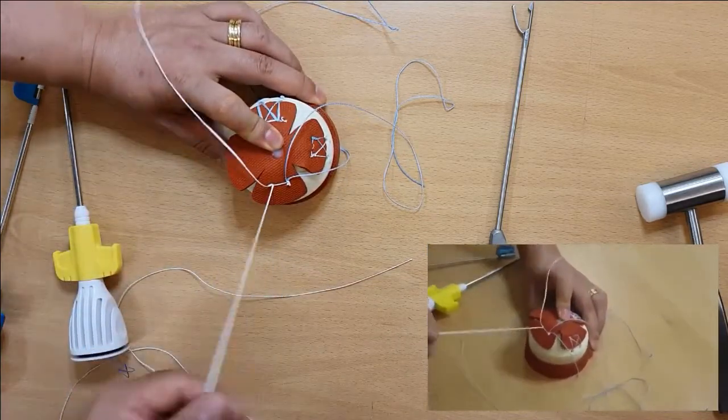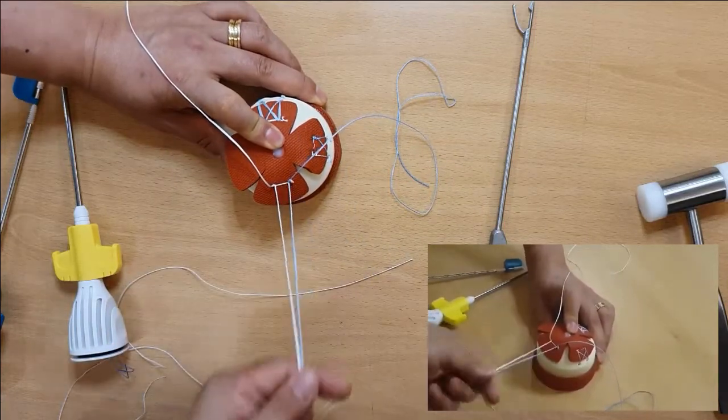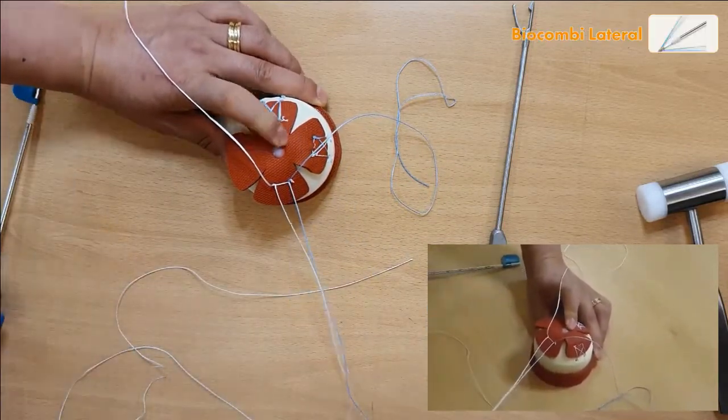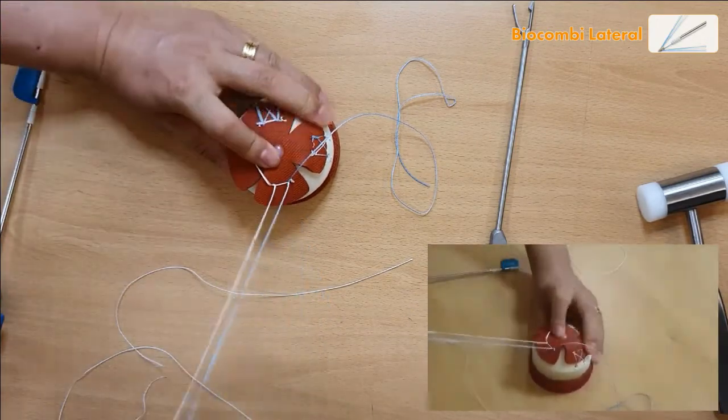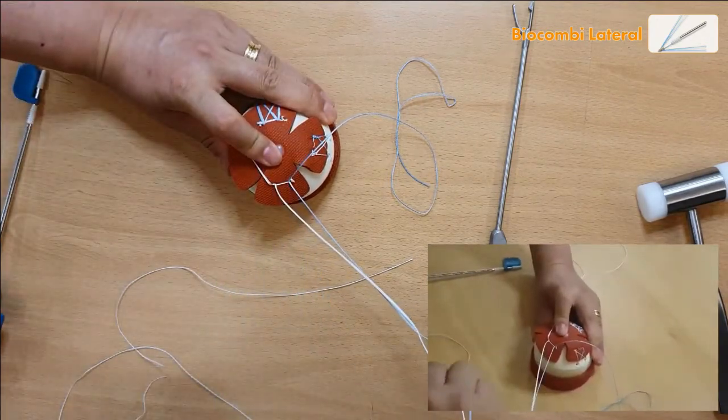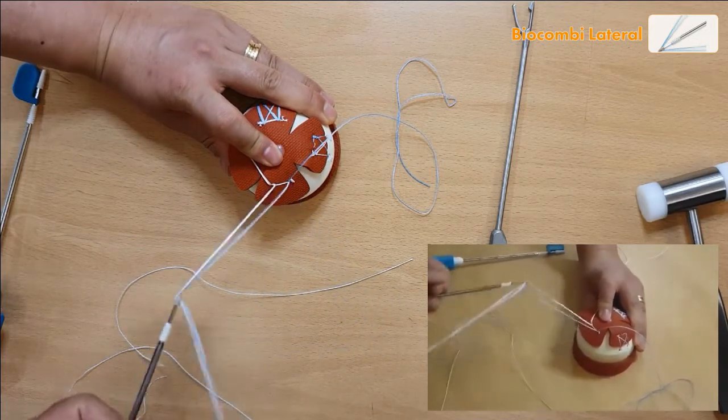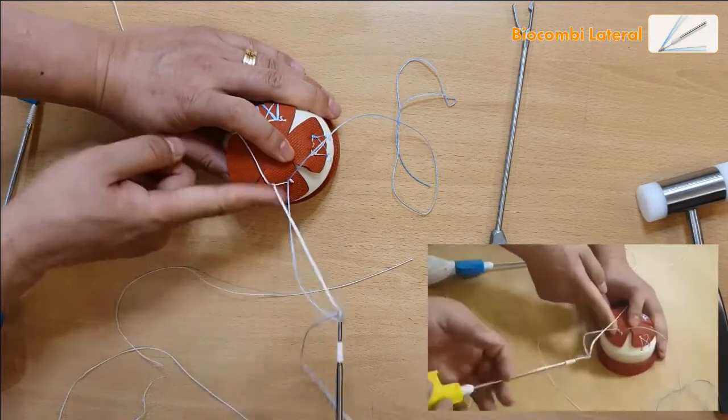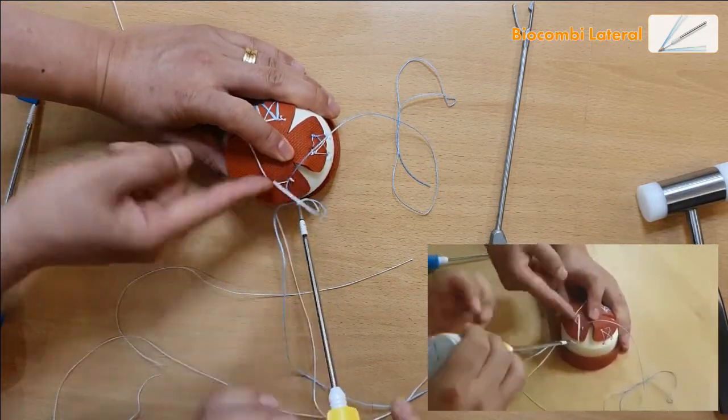Now fiber tape, each strand of blue and white on the medial side. Pass through the eyelet. It's just self-tapping, so it's really easy to use.